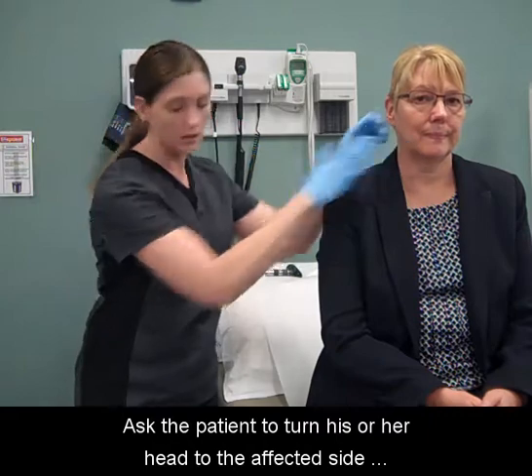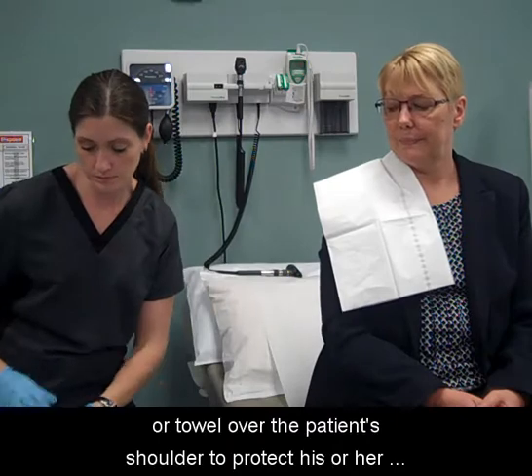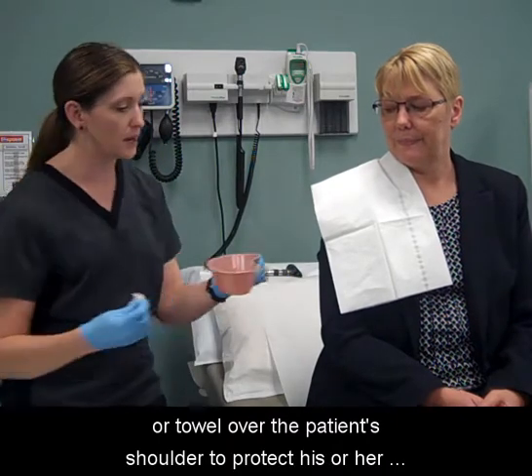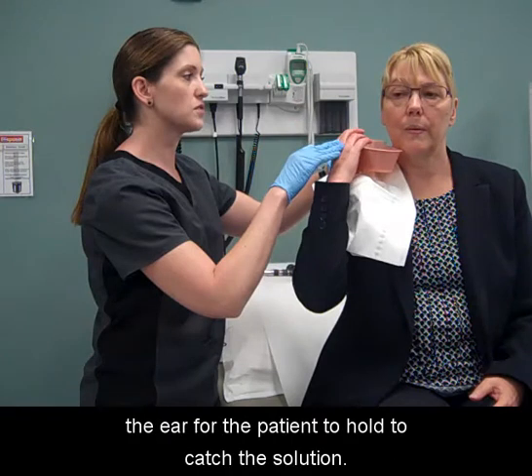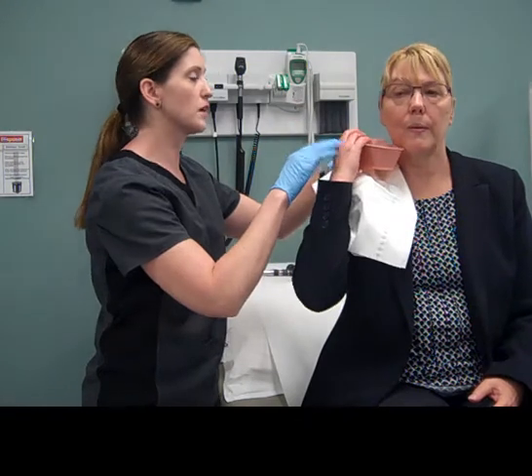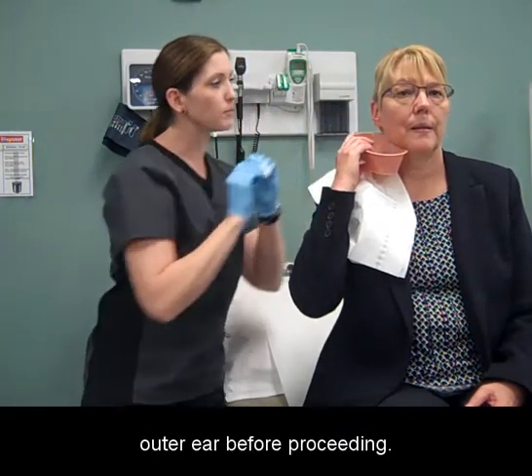Ask the patient to turn his or her head to the affected side and toward the back. Place a water-absorbent pad or towel over the patient's shoulder to protect his or her clothing. Position the ear basin under the ear for the patient to hold to catch the solution. Use a gauze square to wipe away any particles from the outer ear before proceeding.